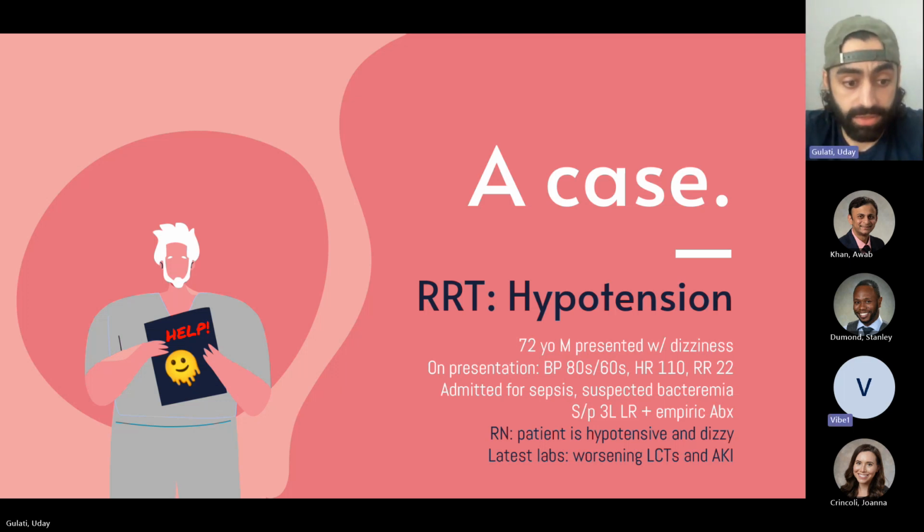Yeah, absolutely. And I think when you have someone this ill, what I would recommend is foregoing the heart exam altogether. Yes, you will eventually look at the heart. Yes, you should do your due diligence and see if there is edema in the lungs, if there is a pericardial effusion around the heart. Does the heart have good contractility? Yes, you will likely eventually measure a cardiac output and see if the patient is possibly in cardiogenic shock. But I think your initial step there was that the patient is hypotensive, so let me give fluids.